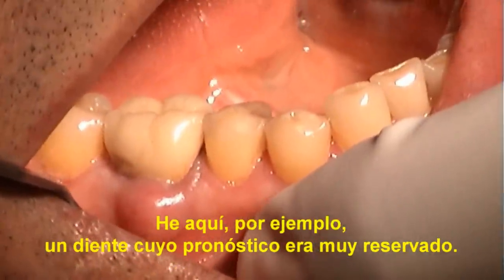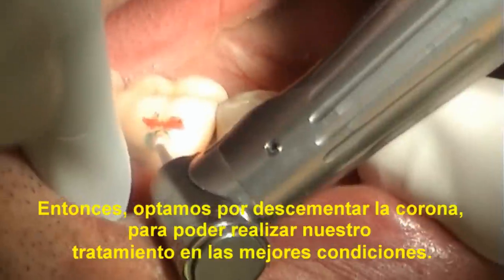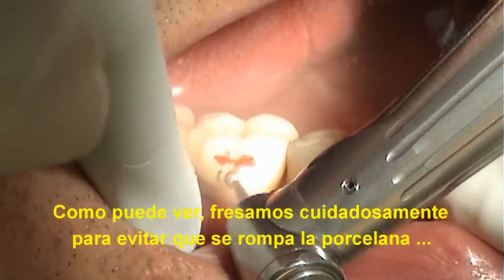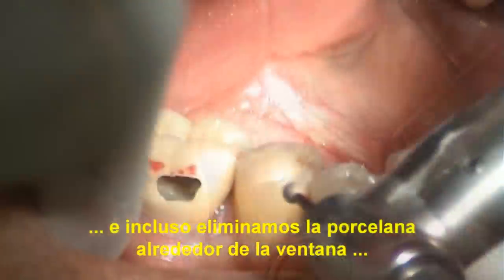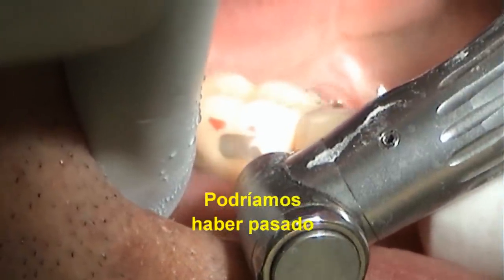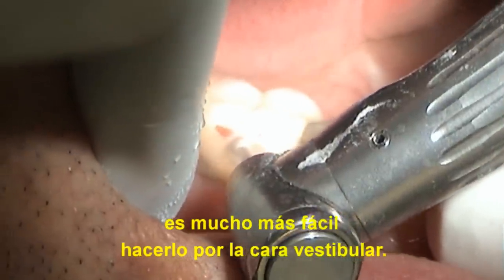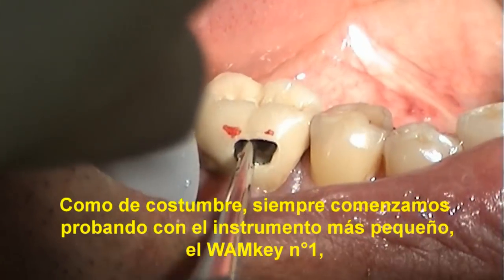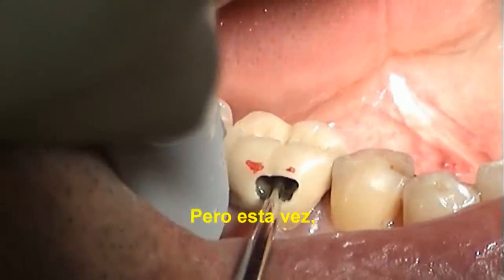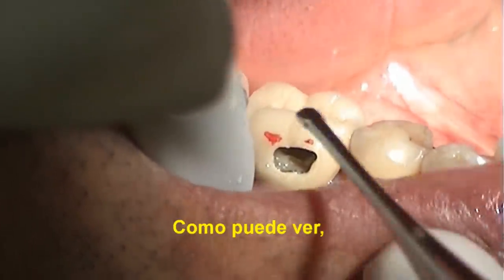Here is an example of a tooth that had a really poor prognosis. The patient was not ready to get an implant, so we preferred to remove his crown in order to do the root canal treatment in the best conditions. As you can see, we drill very cautiously to avoid breaking the porcelain, and we even remove the porcelain around the window to avoid touching it with the One Key. We first tried the smaller instrument — One Key number one — because it works closer to the vertical axis, but this time it was too small and turned loose. So we removed it, tried number two, and as you can see it worked perfectly.